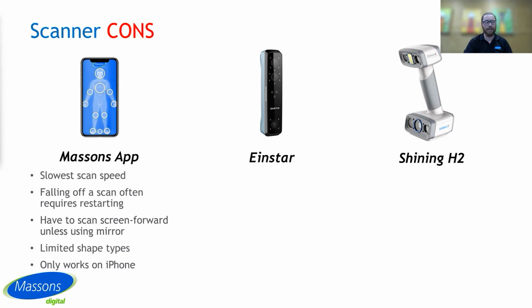It also only works on an iPhone. So sorry out there, Android fans, that technology is not in those phones yet. And so if you don't have an iPhone on hand or one in the clinic and you want to try using the app, you'll have to get your hands on one. The good news is that it runs on iPhones several generations old, so you can pick up one fairly cheap if you need to.